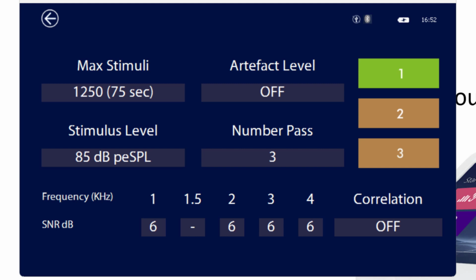But then in a screening environment, there might be a reason that they want to fix it to, for example, 30 seconds. Because for most cases where there is a refer, they don't want it to be manually stopped because someone becomes impatient. They want it to automatically stop, and then it's called a refer. While if someone manually stops, it's called an incomplete test. And when gathering statistics of screening programs, they want to see the difference between the two. So yeah, that's why it's there.